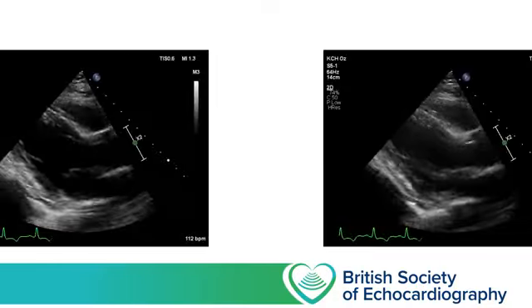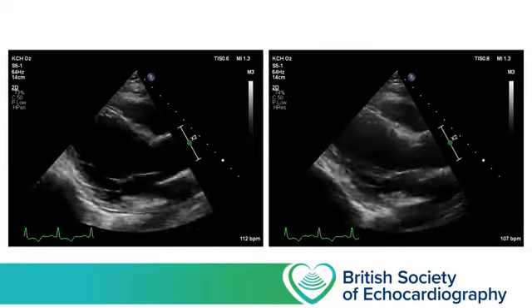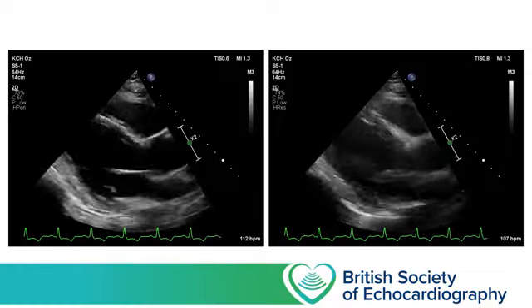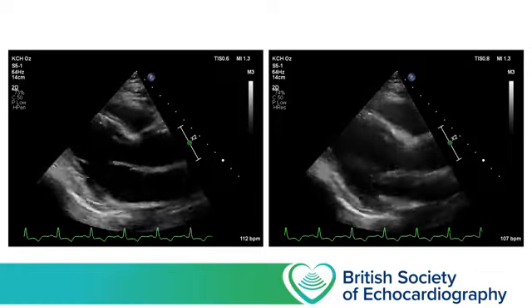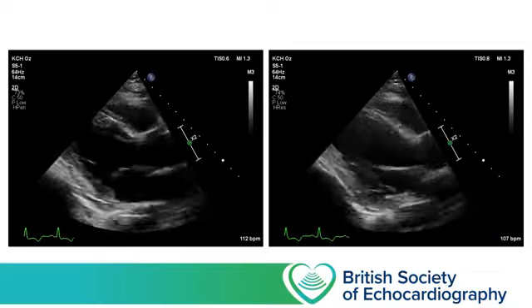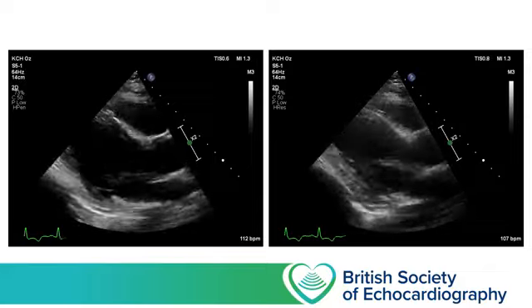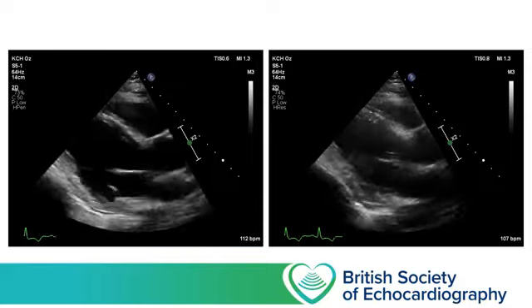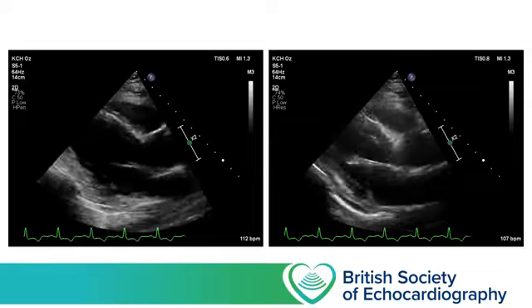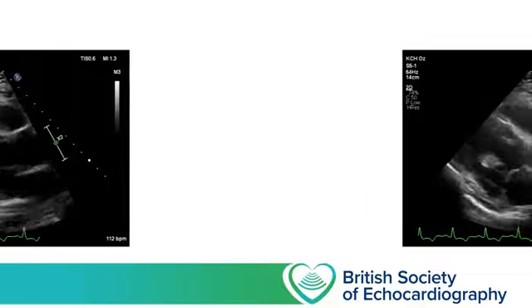In addition, the ultrasound software may allow you to adjust the frequency of a transmitted wave. So here we've got two images, both with the same sector size and the same line density, but the image on the left has been produced using a low frequency ultrasound wave that favours penetration, whereas the image on the right has been generated using a high frequency wave, which favours resolution in the near field, but suffers when trying to image the far field. Once again, neither of these decisions is right or wrong, and if you can adjust the frequency of a transmitted wave, then your decision to do so will be influenced by what it is you're trying to demonstrate.